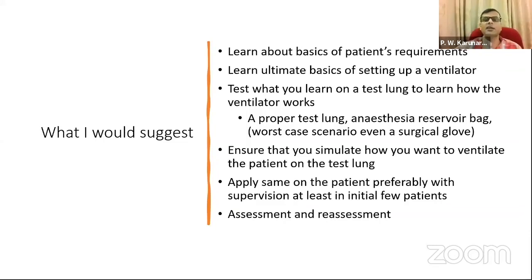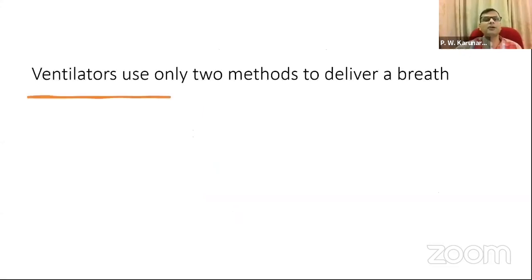At the same time, it can kill people because there is no free flow of air. And then you must make sure the patient's requirements are met using the portable ventilator. It's not impossible, but I'll just try to simplify. First of all, we'll try to learn how a ventilator delivers a breath.